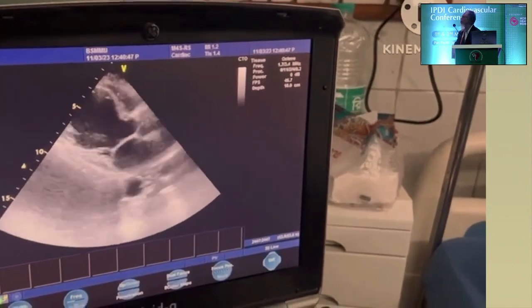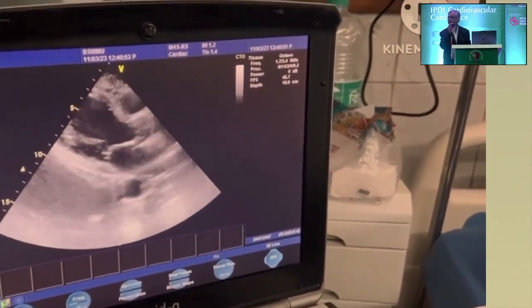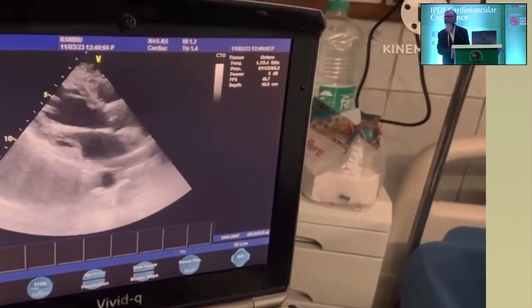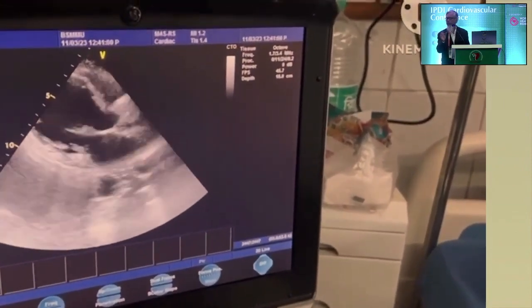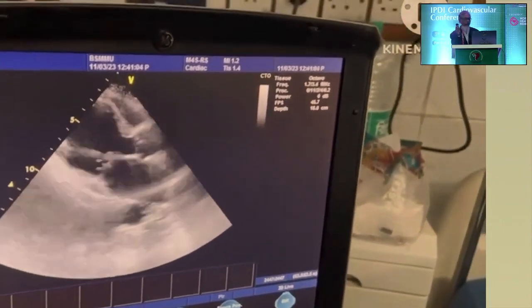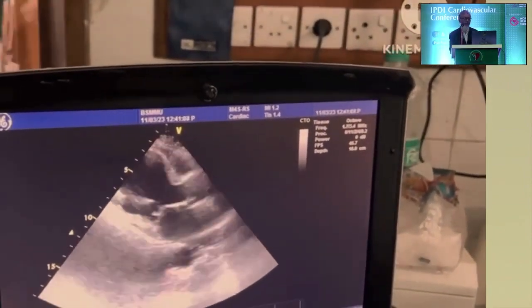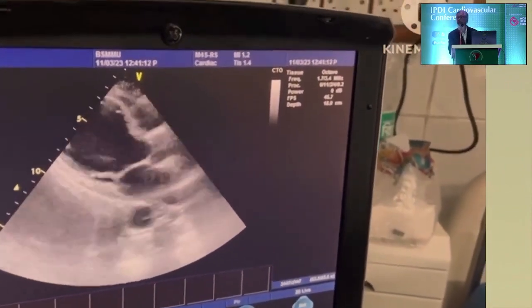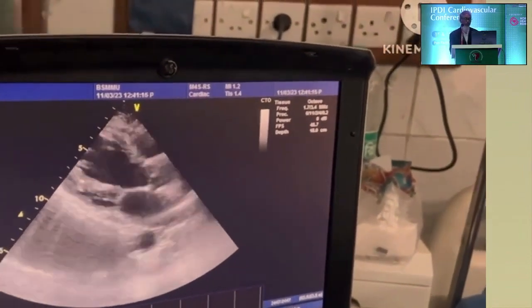So in this, actually, there was a voice here. I cannot produce that voice. Actually, we really cannot see the interventricular septum and the posterior wall much. We really cannot make a clear comment about the posterolateral wall. By increasing the depth, you will see later that the visualization of the septum and the posterior wall is improved.